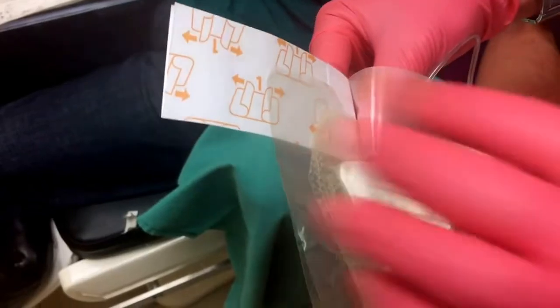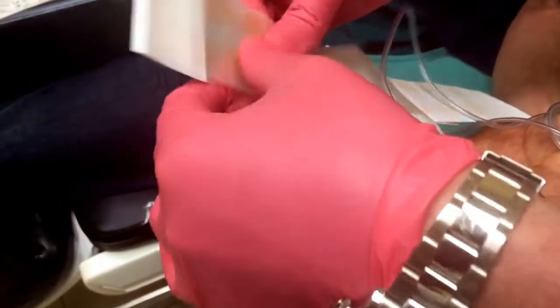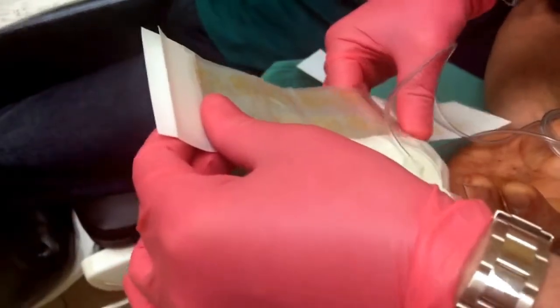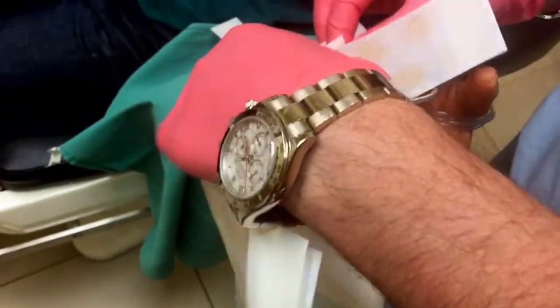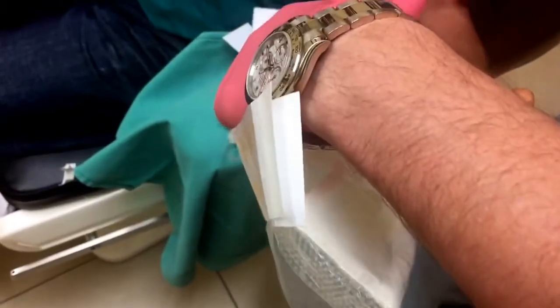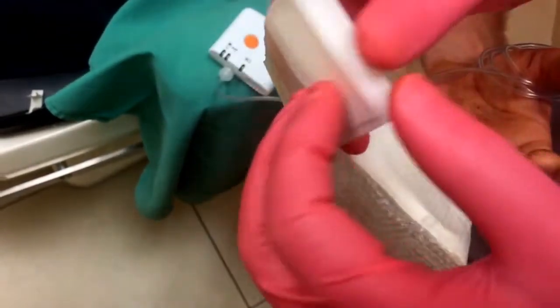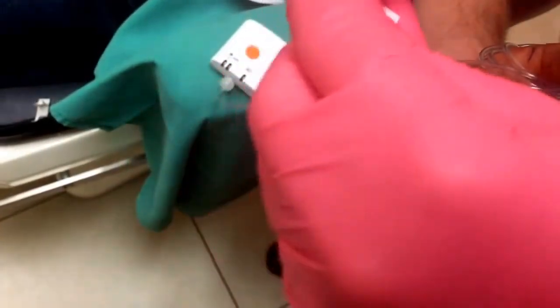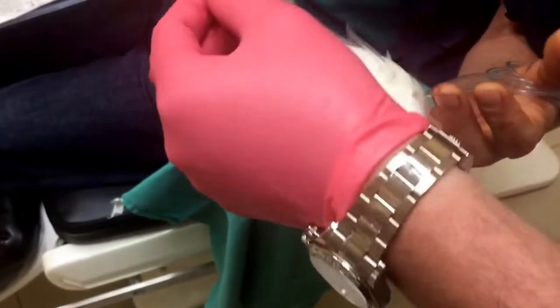And then you take off this one — take off this one — and then you just very gently pinch them together. We're far enough away from his finger that we're not hurting his finger. We replanted his finger and reconnected the nerves, so if you try to do this directly over the fingertip then you're going to have the patient complaining. But he's fine — it's not hurting him. You just very gently take off number two. That comes off. Now that's sealed.